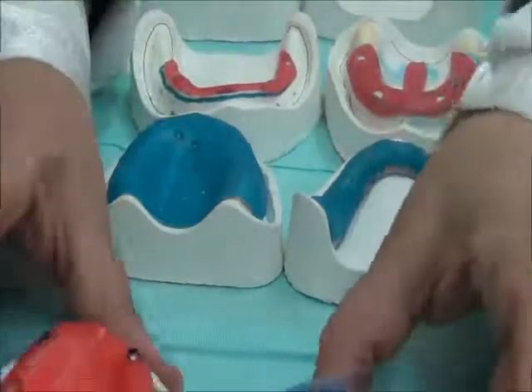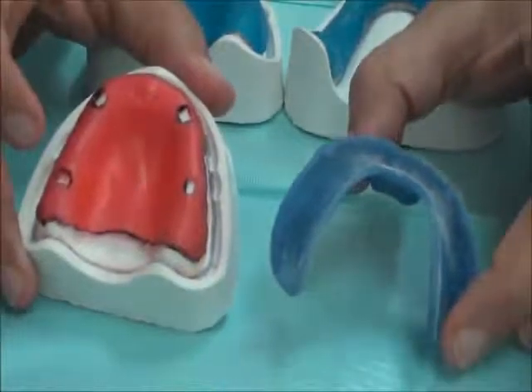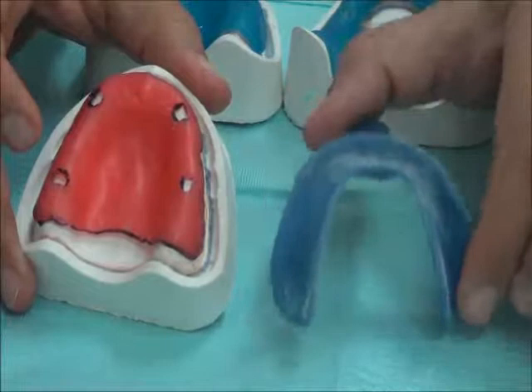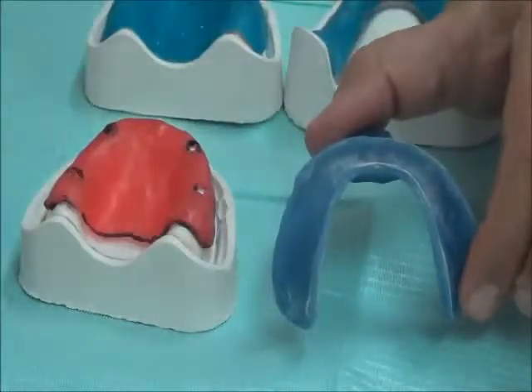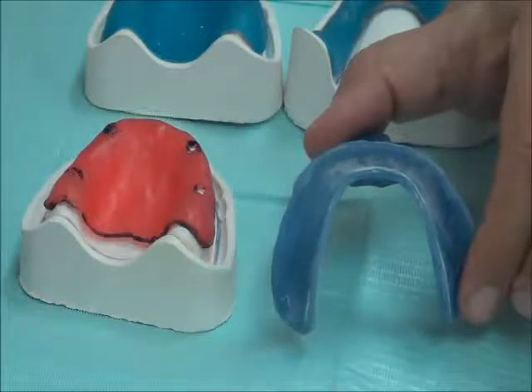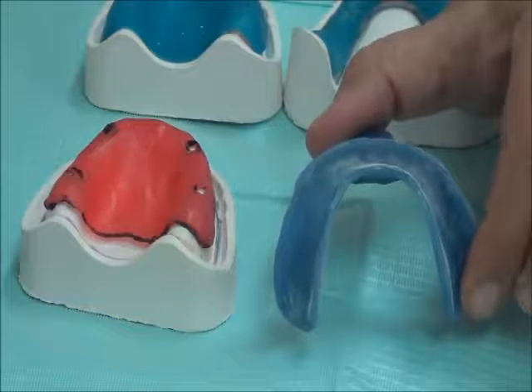But if we have the case of full wax relief or no wax spacer relief with no holes, what will happen is either all of the impression material will be compressed against the soft tissue, and we will have problems later with the compression of the soft tissue in hazardous areas like the nerves, for example.